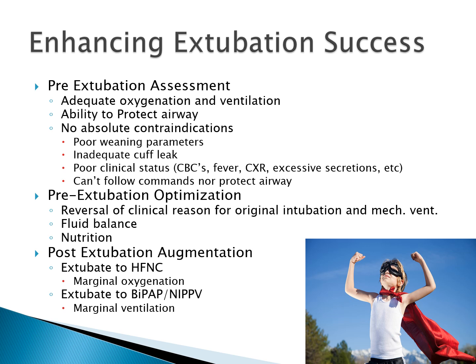So you're using an interface that does not necessarily need to have a vent. I'm talking about not a ventilator, but the masks that we use with typical BiPAP, single limb circuits. The circuit is vented. It has an exhalation port. The mask is vented; it has one or more exhalation ports.